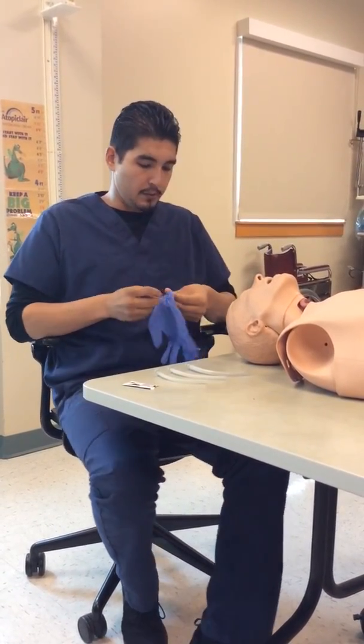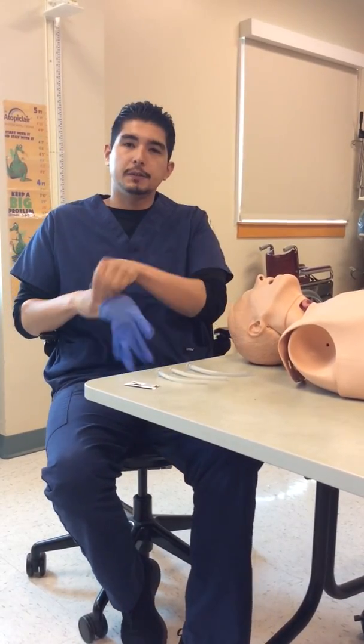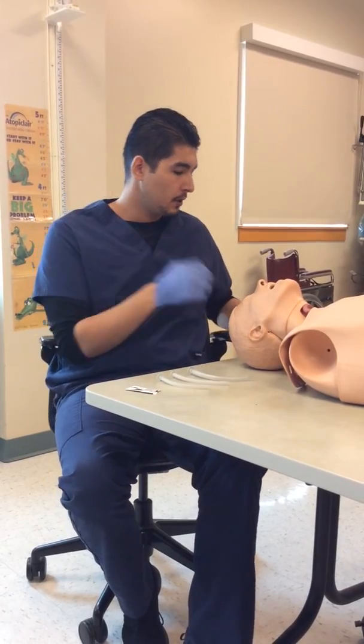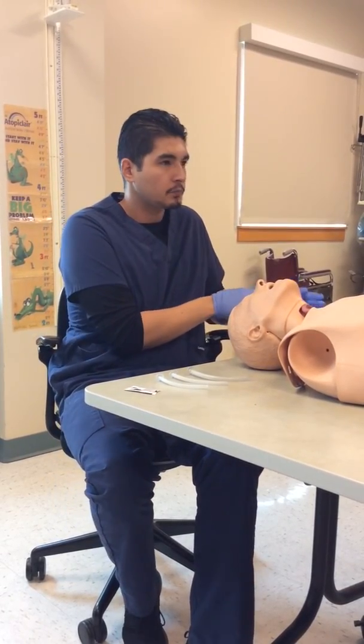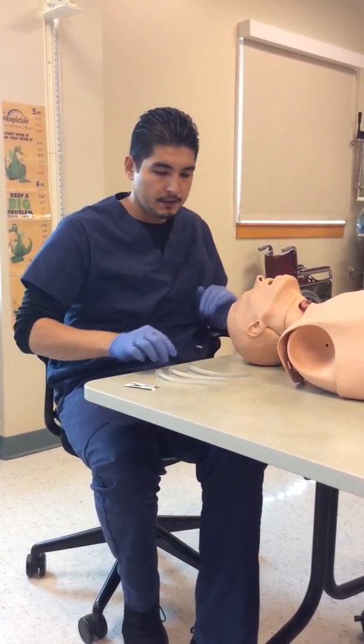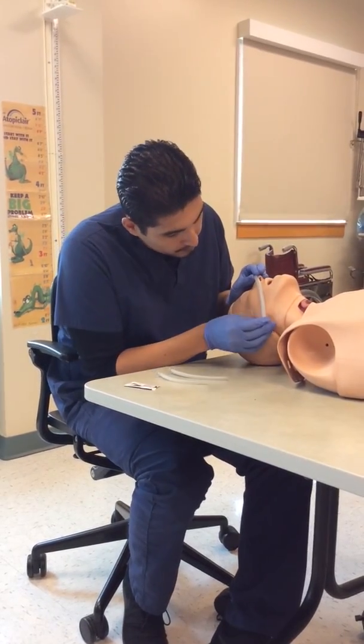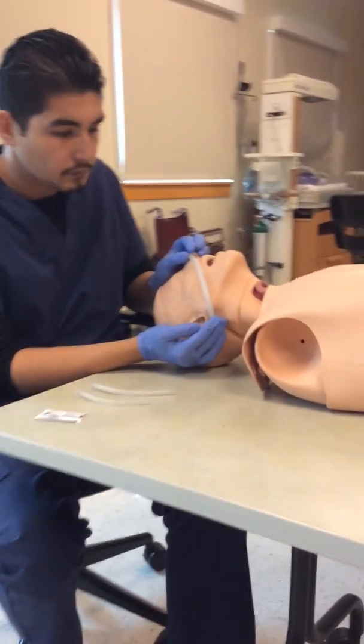So you're going to want to grab your gloves, and just like an OPA, you're going to want to measure your NPA to make sure you have the correct size. So for an NPA, you're going to measure from the tip of the nose to the bottom of the earlobe.